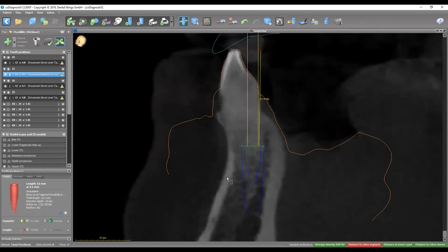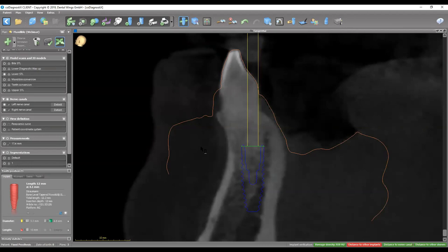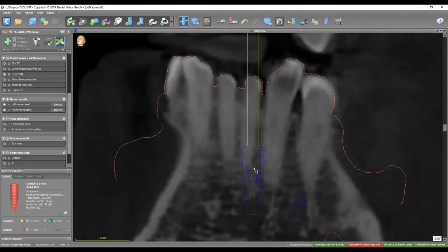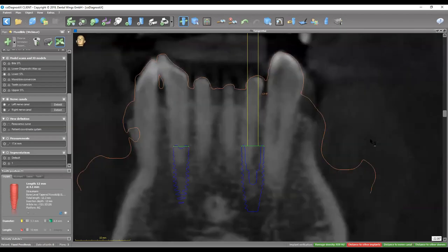We pushed the implant a bit closer to the lingual plate so the lingual threads — at least apically or the middle third — engage a bit of the denser lingual plate, ensuring better primary stability. Whether you want to immediately load the implants or just want the implant stable enough for better long-term prognosis, this positioning helps. We planned the implant to emerge out of the cingulum — the reason is when placing the screw holes, we want them more towards the lingual for better aesthetics and to avoid having the access hole on the buccal surface.